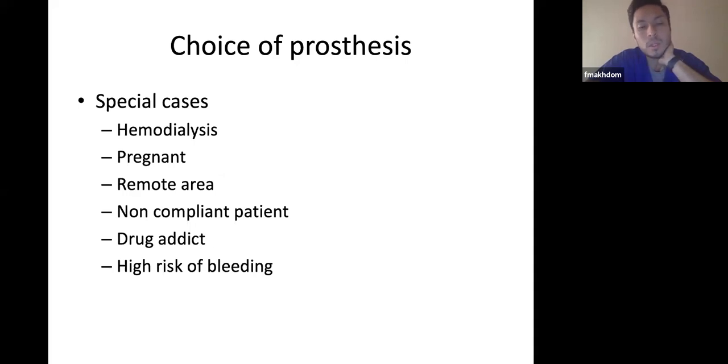Or what is the risk of redoing the intervention, whether AVR or TAVI, depends on the age and the preference of the patient. So this you have to add to the discussion with the patient as well. Okay, so non-compliant, drug addict, high risk of bleeding. Obviously, all of these are special cases you have to consider again in selecting between biological versus mechanical valve.